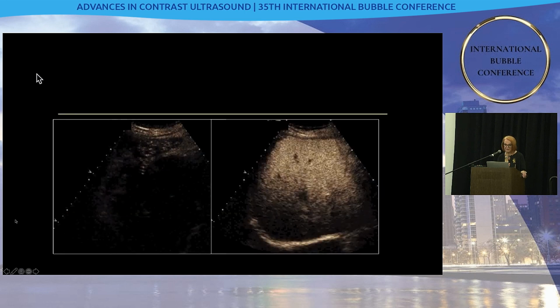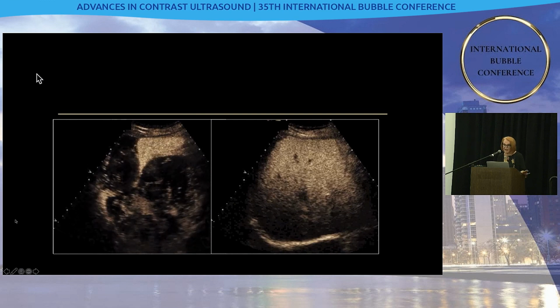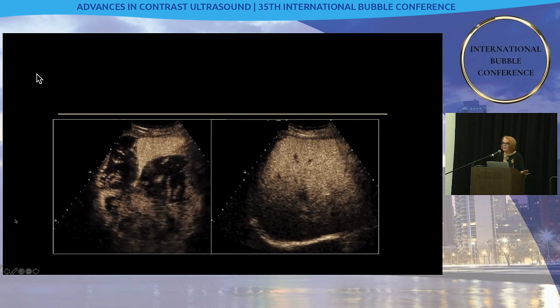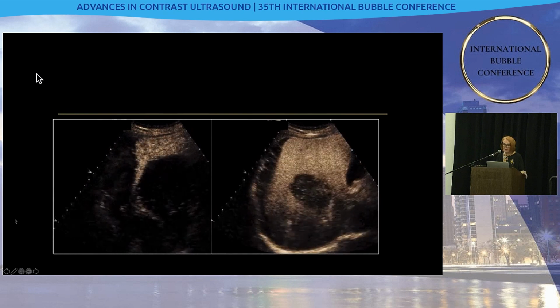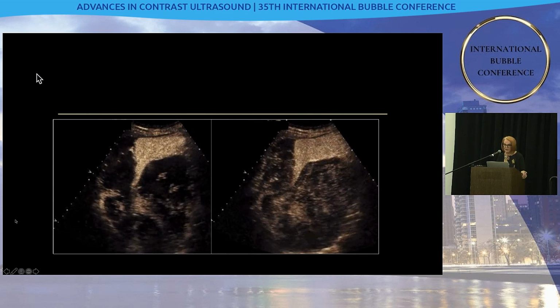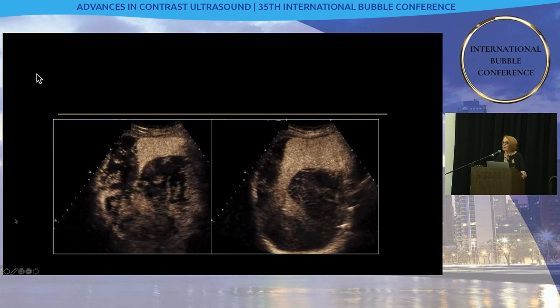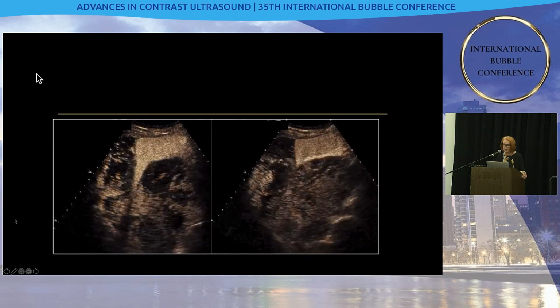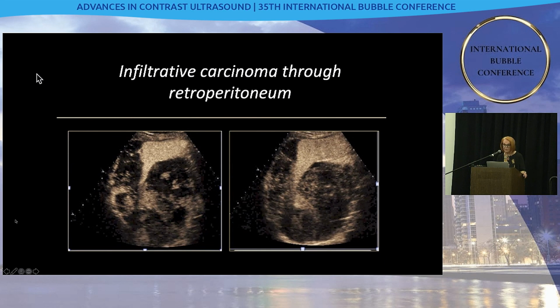We perform contrast-enhanced ultrasound. So here we can see a very nice axial image looking at the liver at the front of the picture, lovely homogeneous enhancement, no problem with the liver. But when we look at the mass where the retroperitoneal hematoma is expected, we see instead that all of this is heterogeneously enhancing material. So this retroperitoneal so-called hematoma is not a hematoma at all, and this enhancing mass which measures up to 20 centimeters in diameter, is in fact reflective of infiltrative carcinoma in the retroperitoneum.